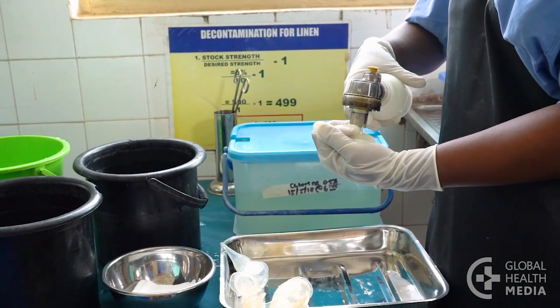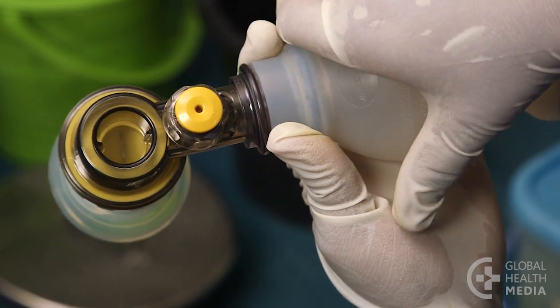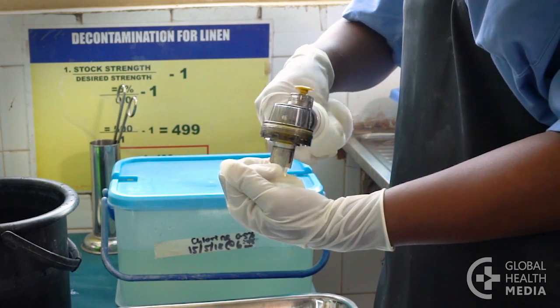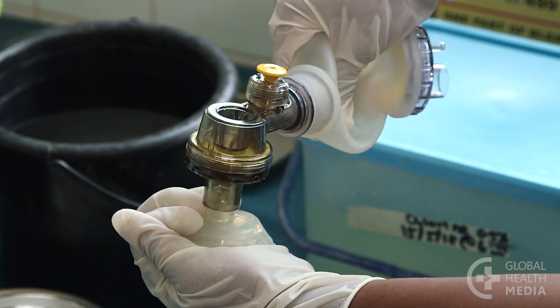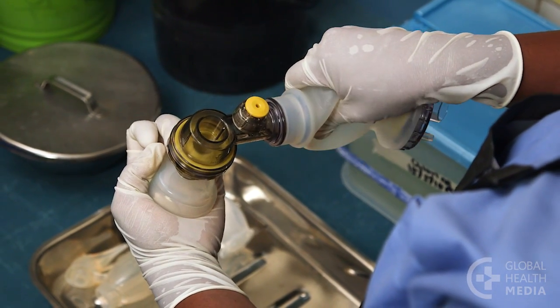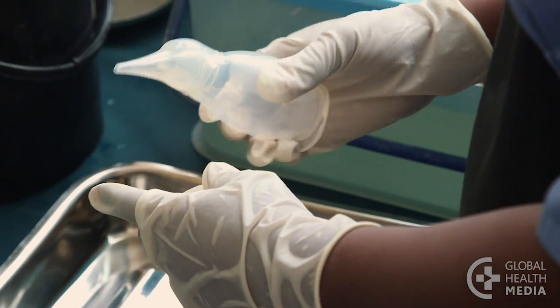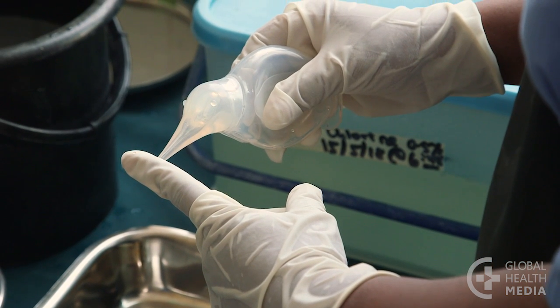Now test that the equipment is working well. First, squeeze the bag and watch for the valve to open and close. Next, make a seal with your palm and squeeze the bag — you should feel pressure against your hand, see the bag re-inflate, and hear air escaping from the pop-off valve. Then test the suction device: squeeze it, block the tip, and release. It should not expand until the tip is free.